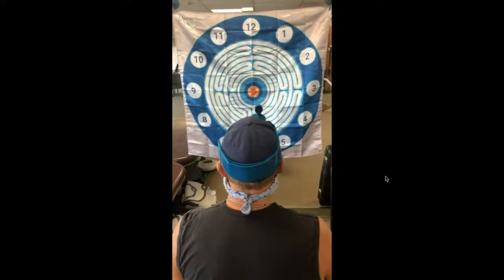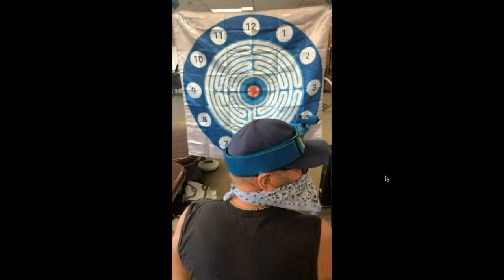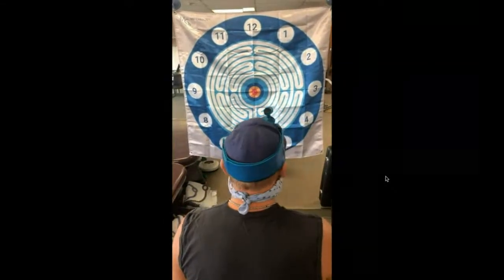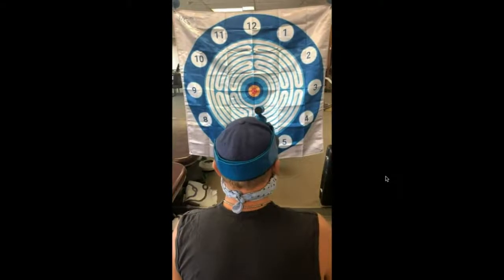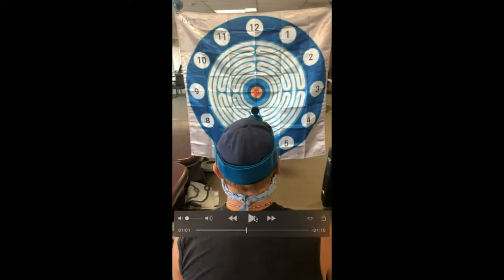Let's do another one. Again, we could do up to 6. But what's going to happen here with his eyes closed? And he thought he made a correction, and he's way off again. So that's 3 out of a potential 6. He already has a positive for a joint position sense error to right rotation. We'd have to redo for left rotation. You can do extension and you can do flexion.